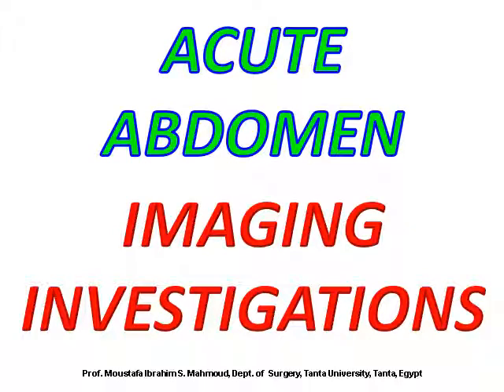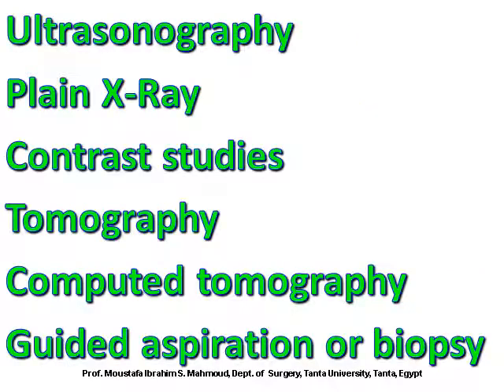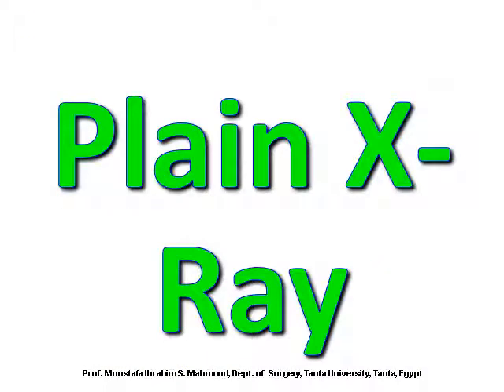Acute abdomen. Imaging investigations. Ultrasonography, plain X-ray, contrast studies, tomography, computed tomography, and guided aspiration or biopsy. Plain X-ray.